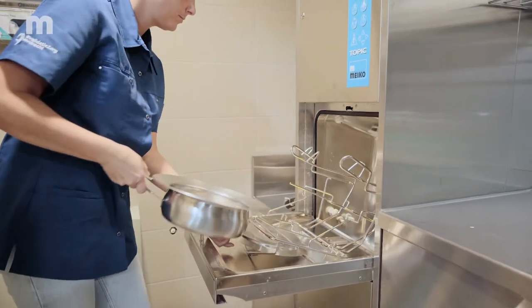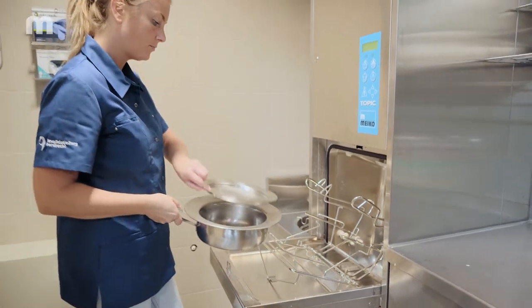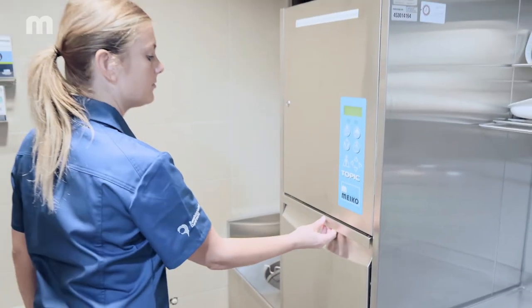Once the cleaning process is completed, you can open the door. Take out the cleaned and disinfected care utensils and close the door again.